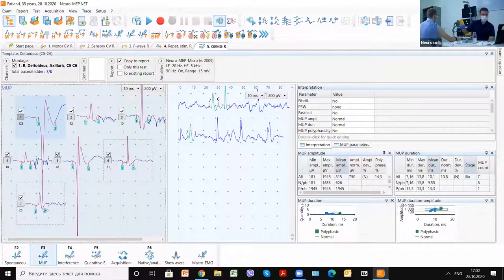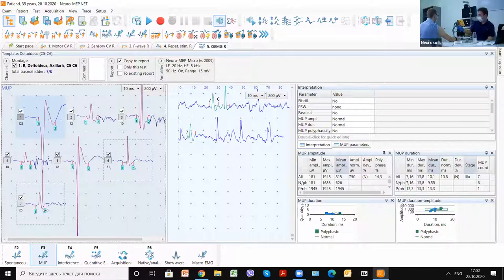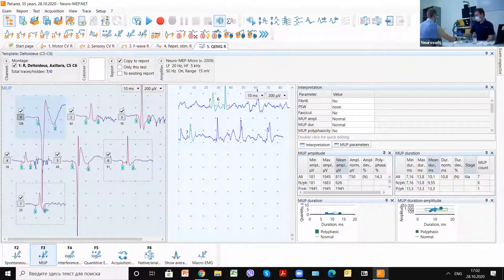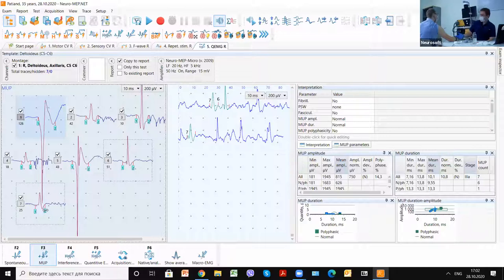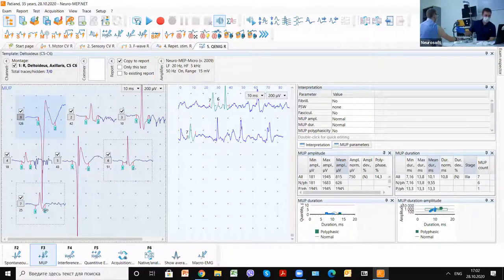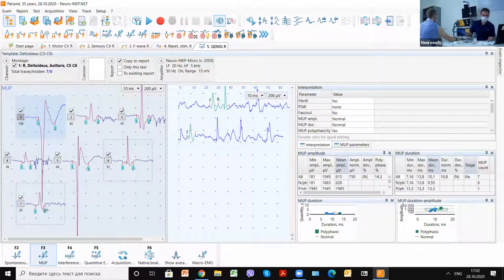And the same way continues several times. For example, when we perform several muscle examinations, at least two muscles usually.